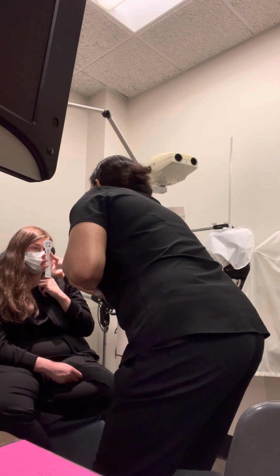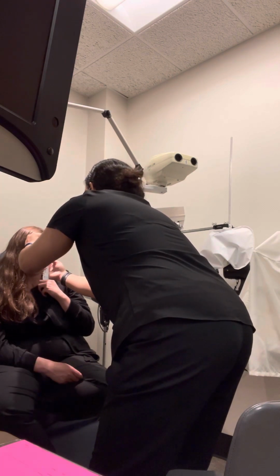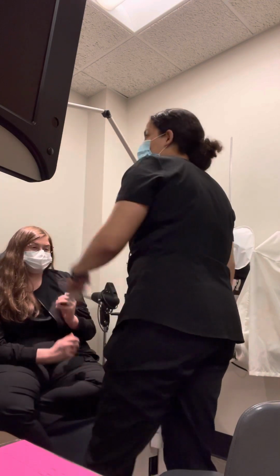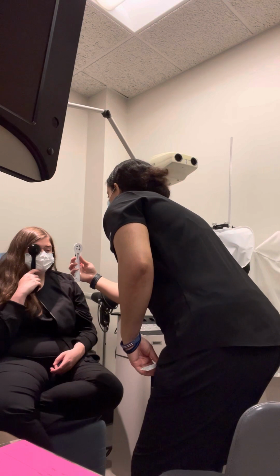No. Okay, go ahead and blink a few times. Does it clear up at all? No. Okay, go ahead and close your eyes for me. Okay, go ahead and cover up the right eye for me. Same thing, staring at the V, let me know when it gets blurry.